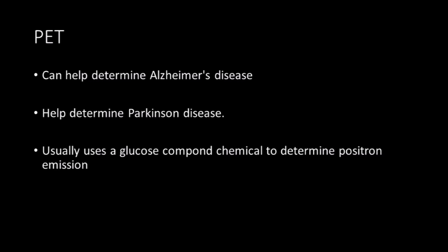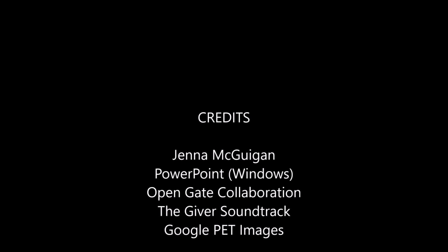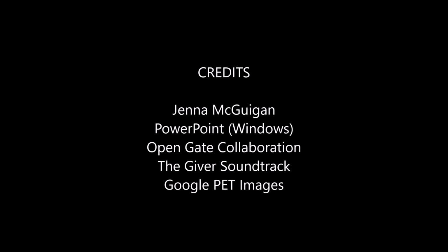So overall, a PET scan, a positron emission tomography, can help determine Alzheimer's disease, Parkinson's disease, many different sorts of cancers, different brain tumors. There's just so many different things in the body that PET scans can help in every way. And all that needs to happen is you need to be injected with some sort of glucose compound chemical to determine your positron emission and where it's coming from. That's what PET scans measure, from those emissions. From when the positron emits, it'll measure exactly where it came from in the body.